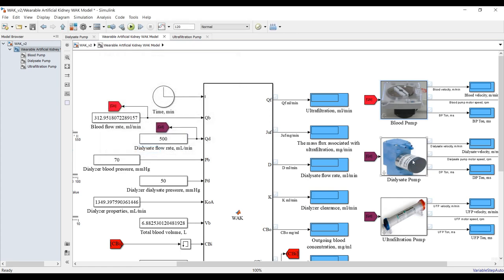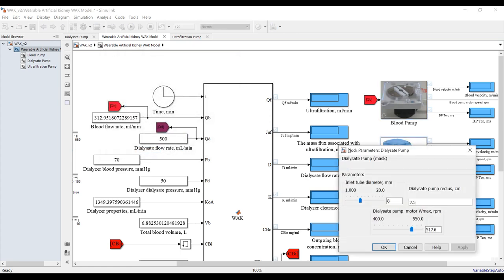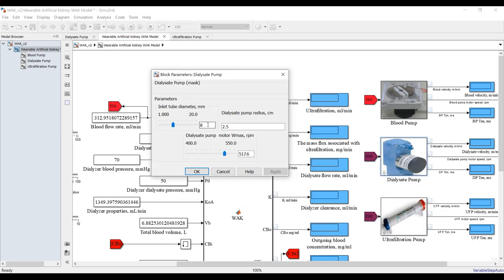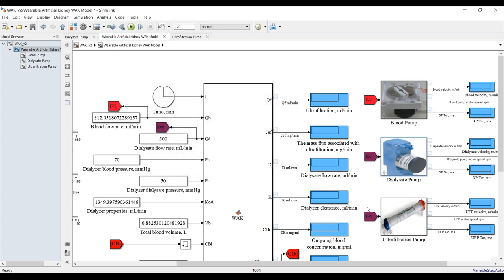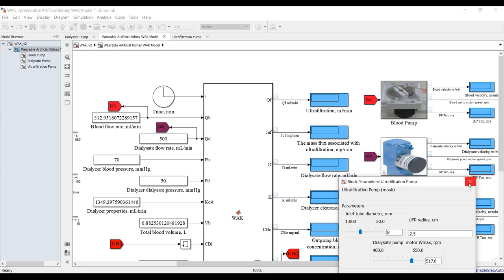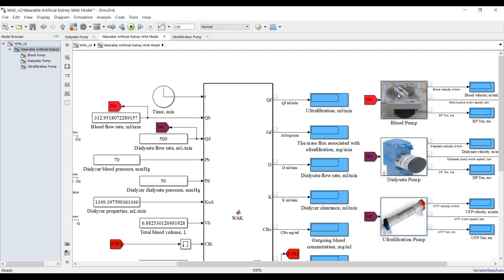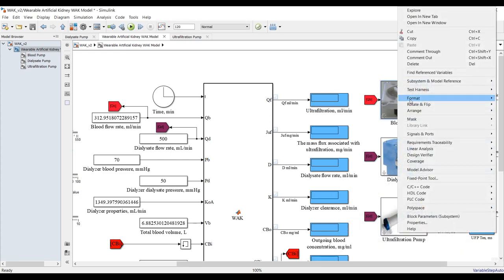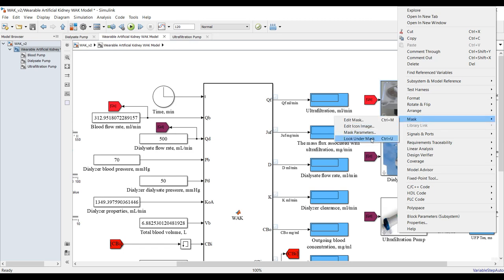You can control these parameters. The same applies for the dialysis pump — we have specifications for the bump radius, tube diameter, and motor maximum RPM. The same goes for ultrafiltration. You can right-click and go to the mask, or look under the mask.